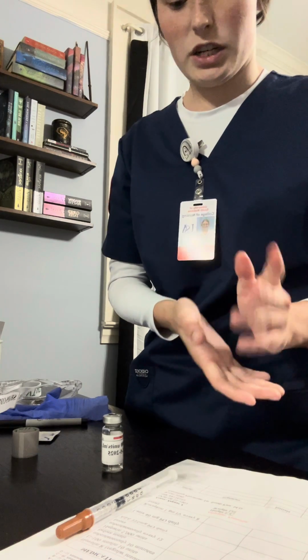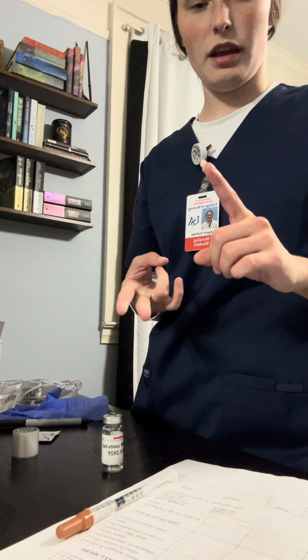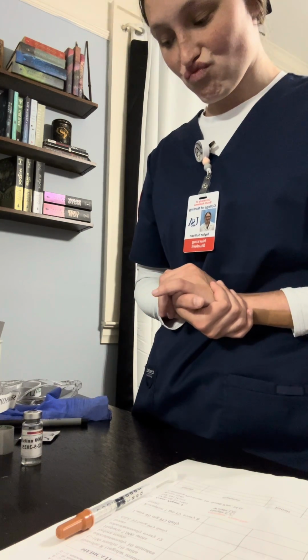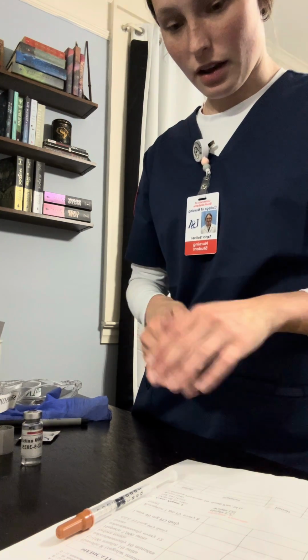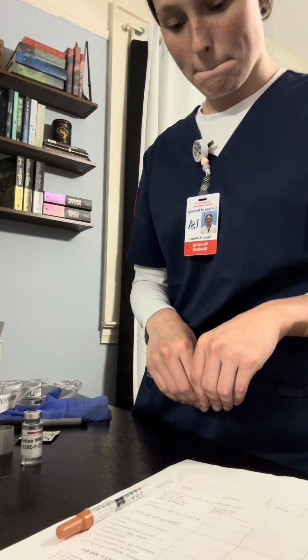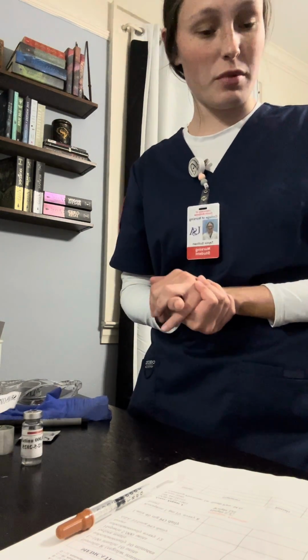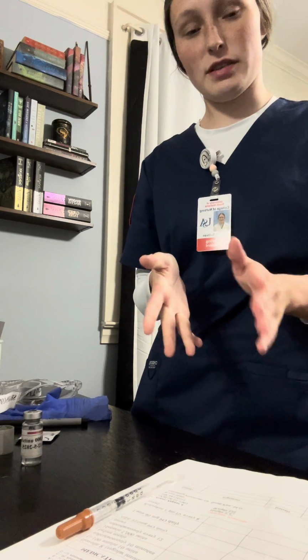So before I would give this injection, I would double check my calculations and the dose with another nurse. Before I move on, I think I did all of the checks, the 7 rights. Did my tuberculin, got that. Okay, so now I am done with my first check of accuracy. I am now going to start my second check.